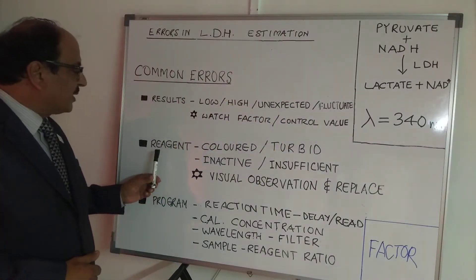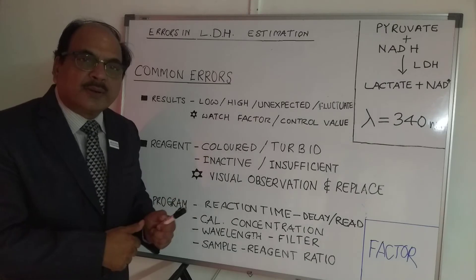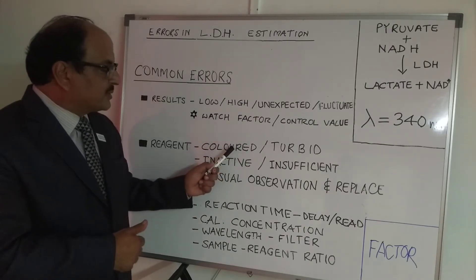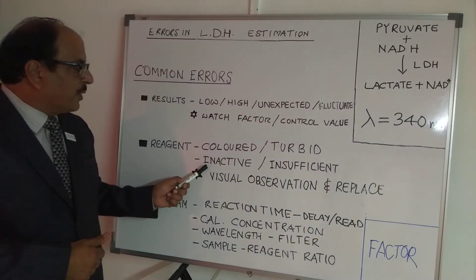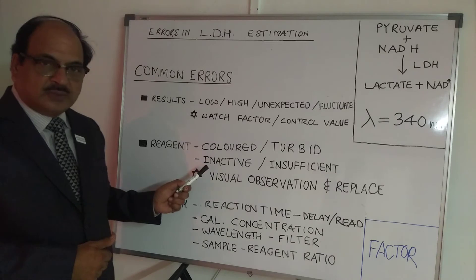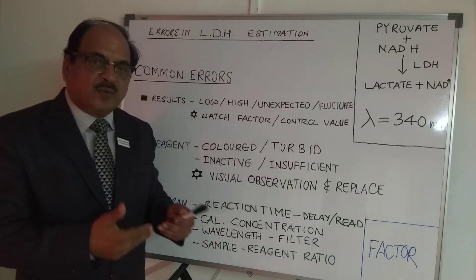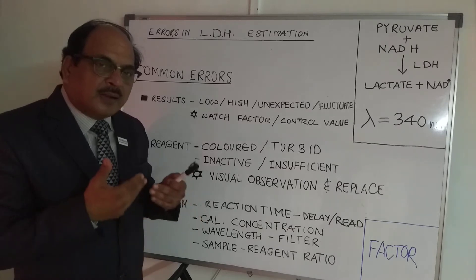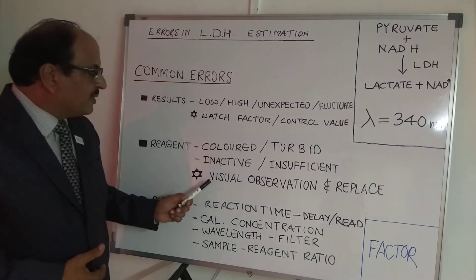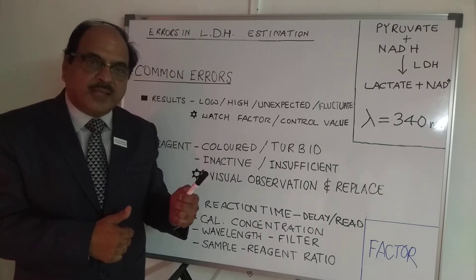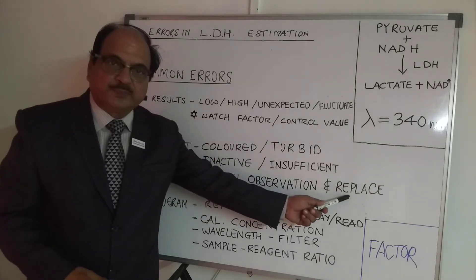The second category is reagent-oriented errors. Although LDH reagent is a two-reagent system, it is transparent. Any abnormal color, turbidity, gross contamination causing inactivity, or insufficient reagent — such as air being sucked in during the last few milliliters — can cause errors. These can be eliminated by visually inspecting the reagent in a test tube or beaker. If turbid, colored, or abnormal, discard and replace the reagent.